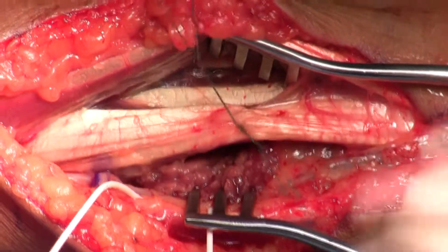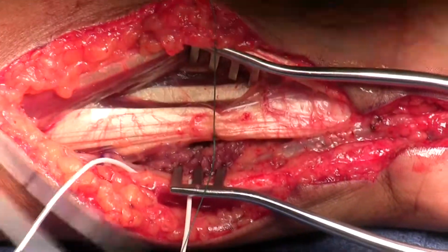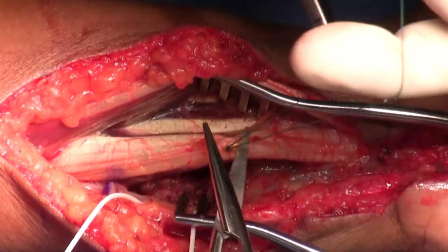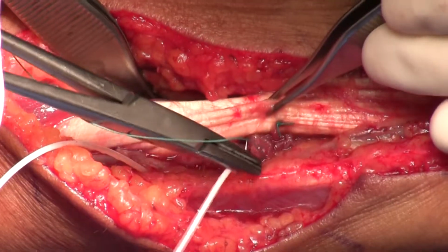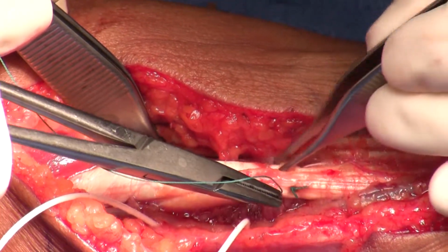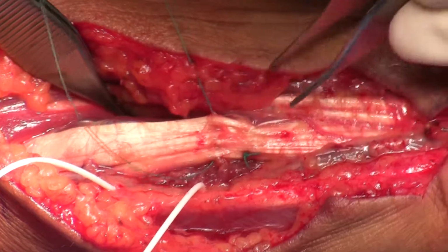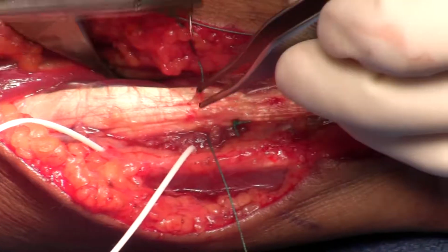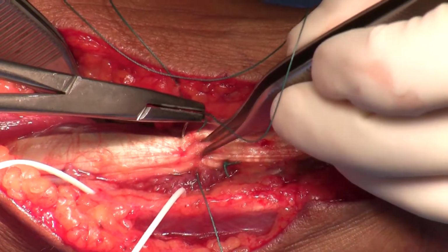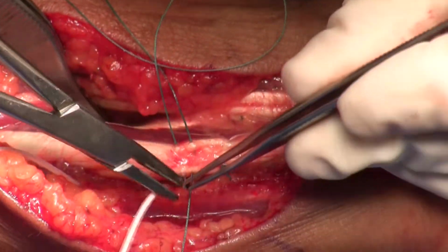Such a fun little easy thing to do to give that patient some immediate ulnar nerve extrinsic function. And you can see the muscle below is the pronator quadratus, where we've set up the AIN nerve transfer for our ulnar intrinsic function. Now just back and forth here, the tension is set with that first one. If it isn't right, then all these extra ones won't be right. But if it is right, then this just gives you sort of an additional tenodesis between those profundus tendons.